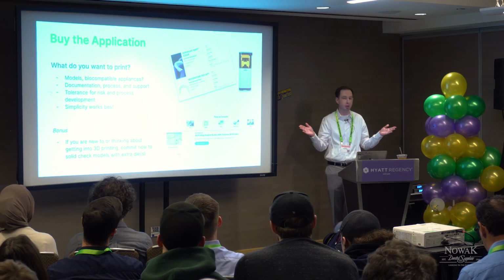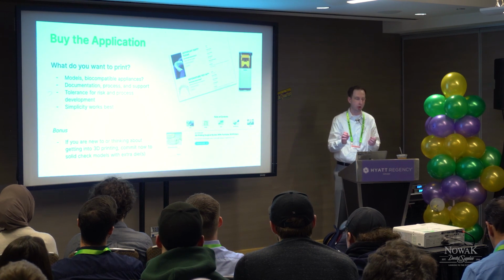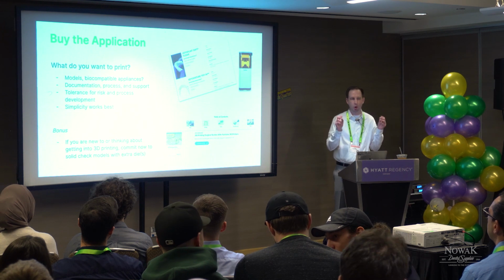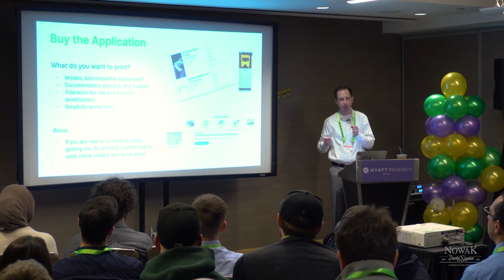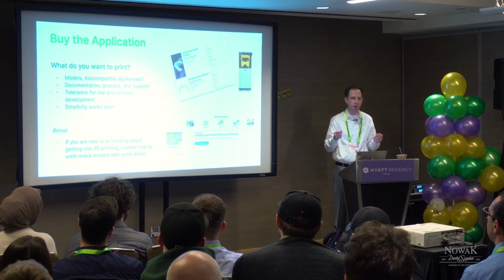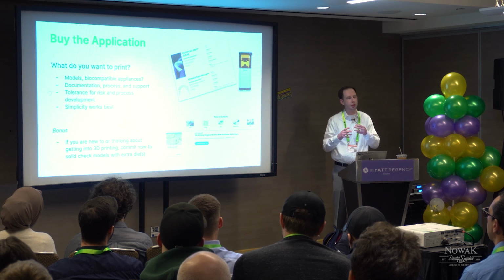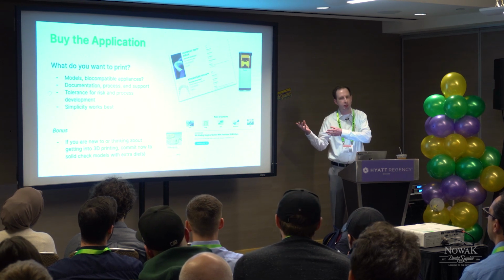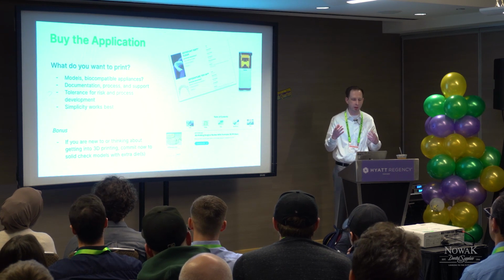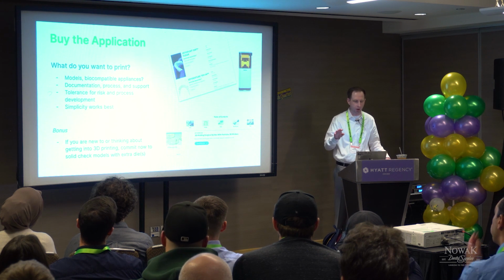So what do you want to print? The first thing I ask anybody that asks me about 3D printing is, what do you want to print? If you just want to do models, it's a much different conversation than models and dentures, splints. So what is really your print? And if it is dentures, do you want to convert your customers to printed dentures, or is it a need? That can sort of adjust how you're thinking about your appetite for this endeavor, right?